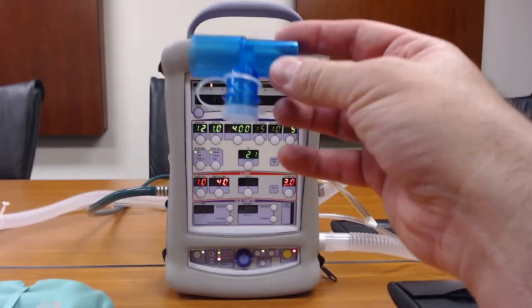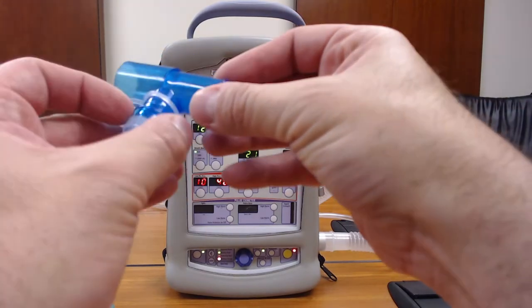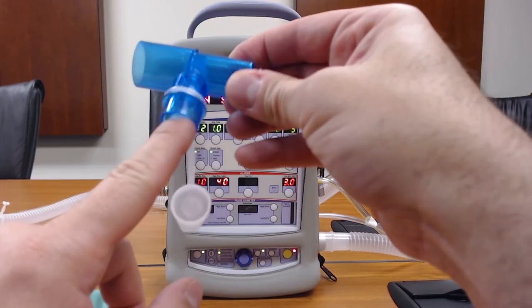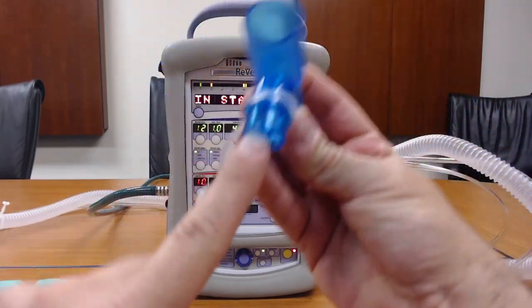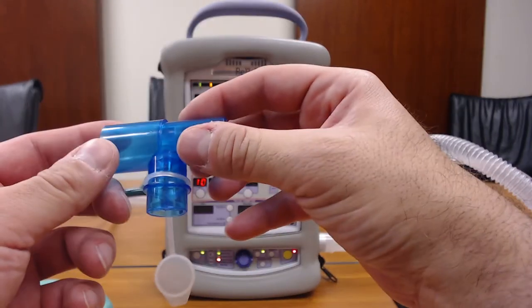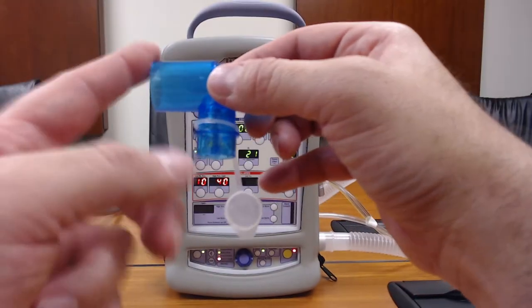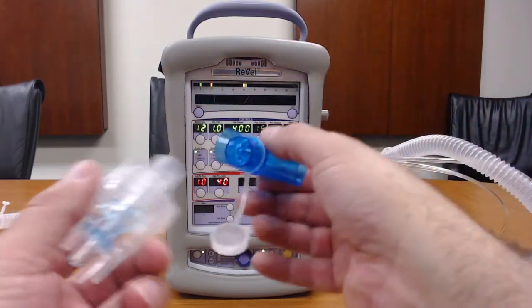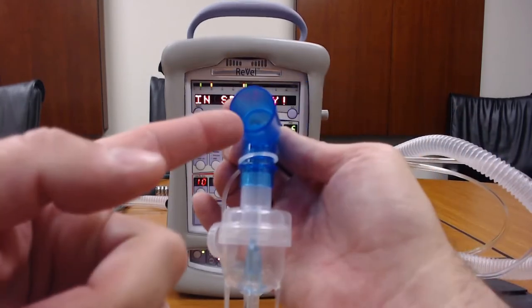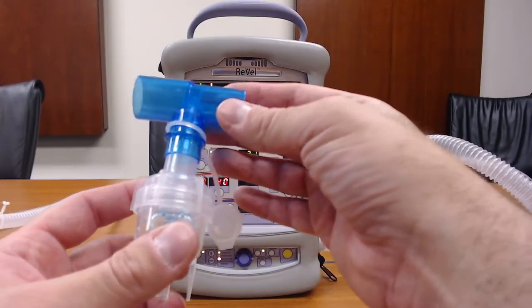To utilize the vent, you're going to need a separate T-piece connector with a valve built into it. As you can see, it's spring-loaded — when you press it up, it opens up the valve. This allows for maintaining the closed-loop system within the ventilator circuit. When you put your chamber inside, it lifts up the valve and allows medication to be dispensed through the system.